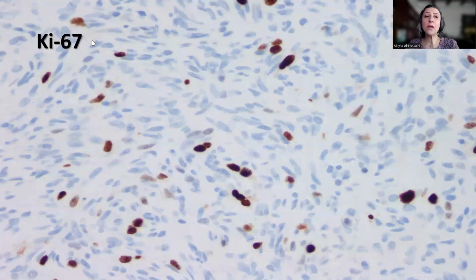And I always perform Ki-67. It actually helps me look for hotspots or areas of increased mitotic activity. I almost always do it, and then find this area, map it on the Ki-67 and then on the corresponding H&E slide, and go and count mitoses in the hotspot.